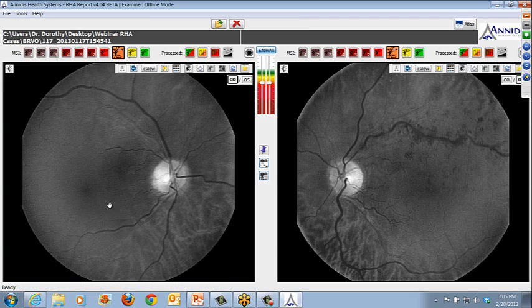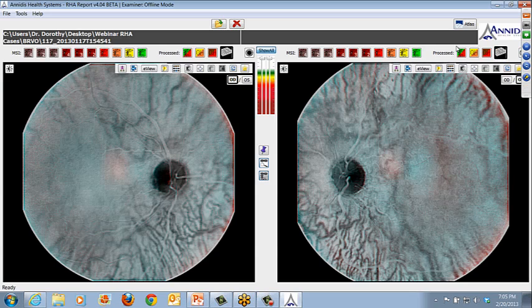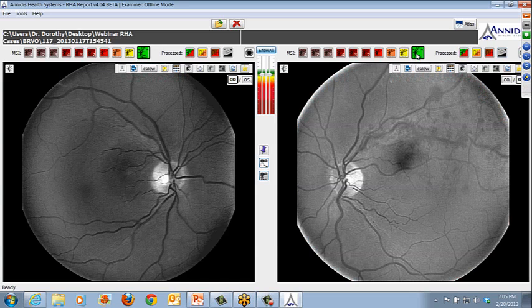Okay, so I want you to primarily take a look at this eye here. And I don't think I need to explain what the pathology here is. I think everybody would easily recognize what this is. And with any retinal vascular occlusion, in this case it's branch retinal or hemiretinal vein occlusion, you're going to see hemorrhages, potentially exudate, and if it's more ischemic BRVO, you're going to see a broader representation of cotton wool spots.